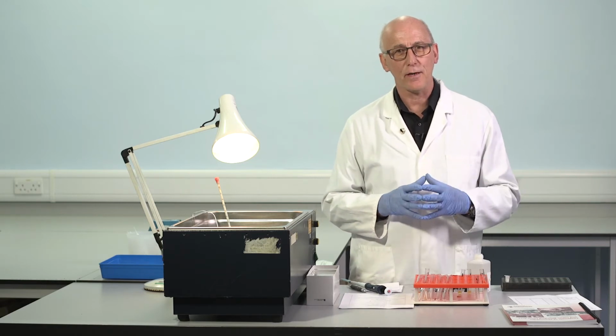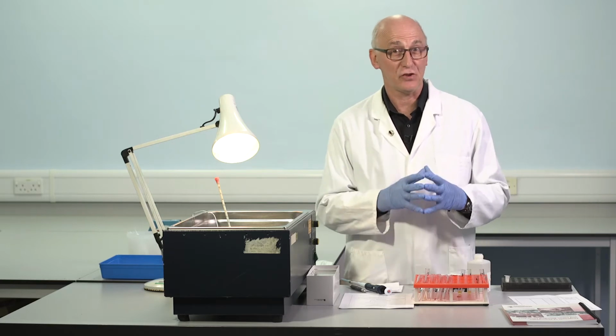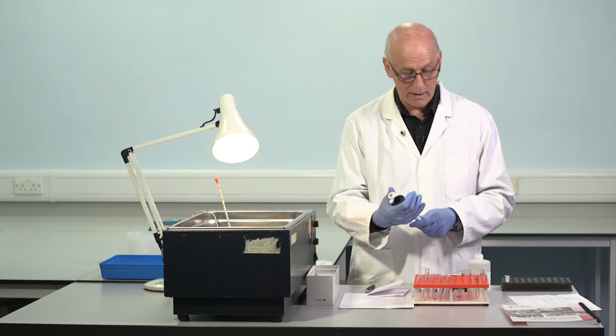So at least 2 of the 3 should be made independently. It's fine to make all 3 independently, but at least 2 should be independently made. So to make a 1 in 10, 1 in 20, 1 in 40, we're going to mix 100 microlitres plus 900, 1 in 10, 100 microlitres plus 1.9, 100 microlitres plus 3.9. So we'll make the 3 independently just now.